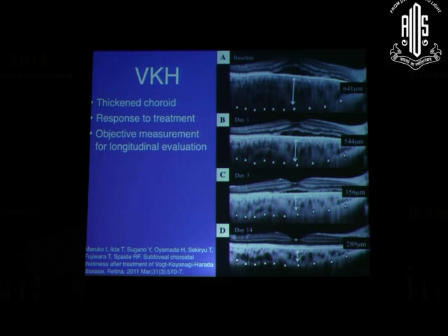At the same time, to look at the choroidal infiltrates, you look at the vasculature of the choroid. In active disease, you don't see the vasculature that clearly, basically because the inflammation is happening in that area. There are inflammatory cells, there is edema, so there is a thickened choroid. But it's not just a thickened choroid. You can look at the architecture of the choroidal vasculature, which might tell you that the disease is still active. So we need more studies to assess exactly which characteristics we need to look at to decide activity, but definitely there are some changes which we need to assess.